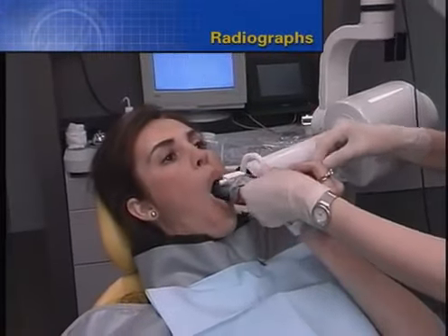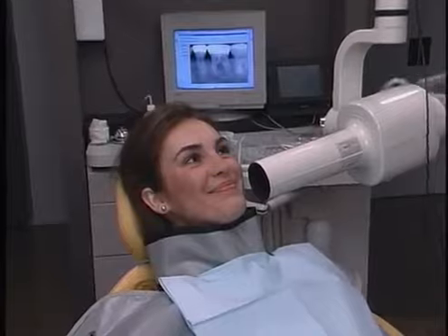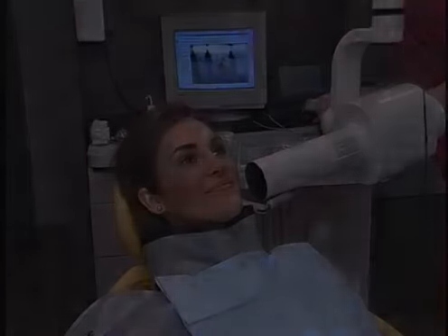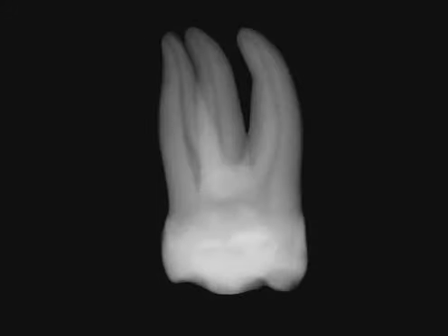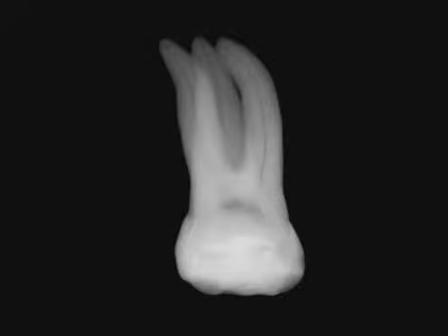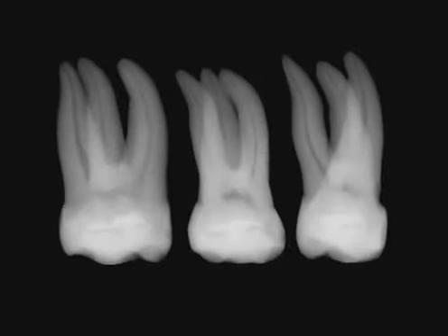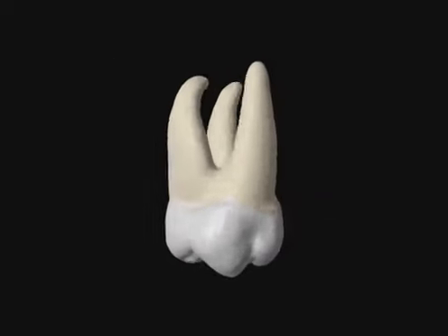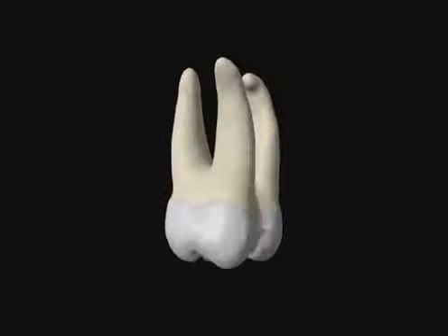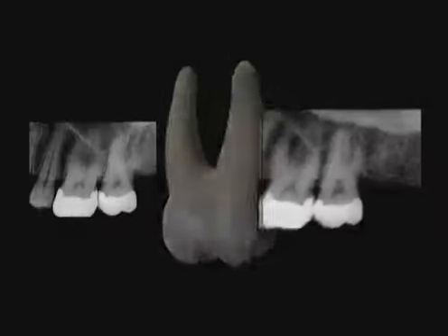Clinicians should take 3 well-angulated radiographs prior to initiating treatment in order to better appreciate the three-dimensionality of any given tooth. From an endodontic standpoint, preoperative films should include mesial, distal, and straight-on angles. These views will better prepare the clinician for root canal treatment. 3 films in combination are more valuable than a single film alone, and give us important information as to the buccolingual dimensions, concavities, and extra canals.